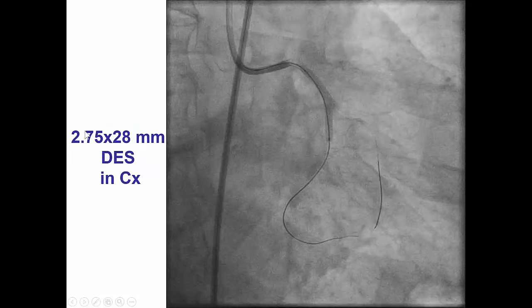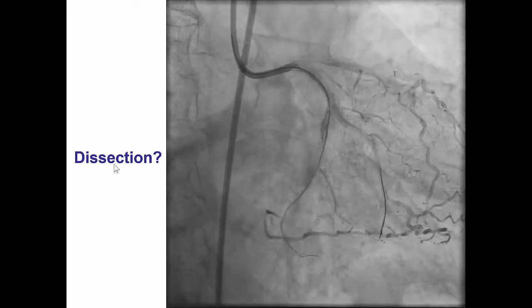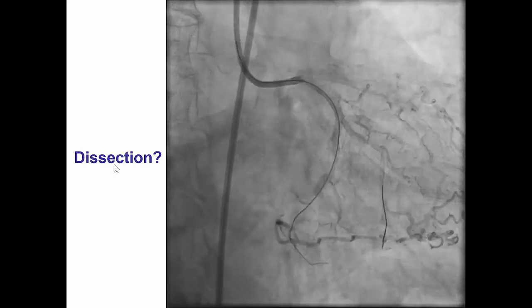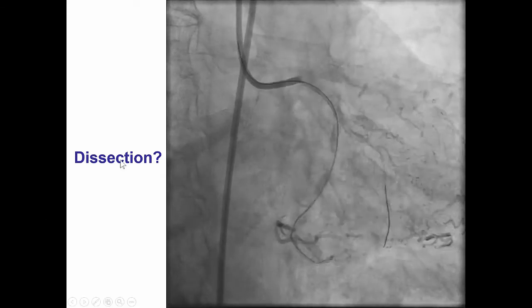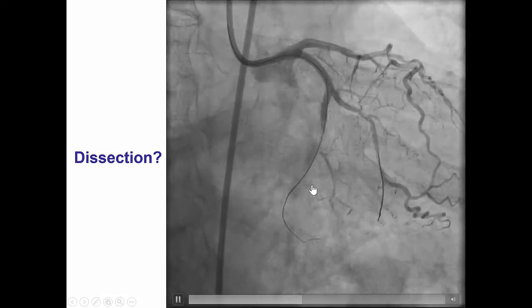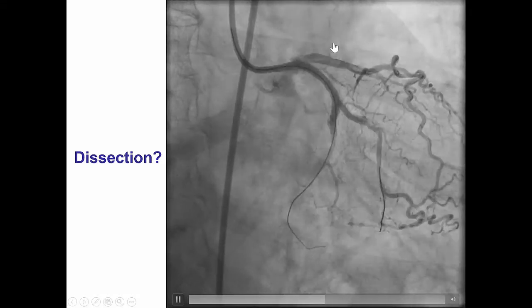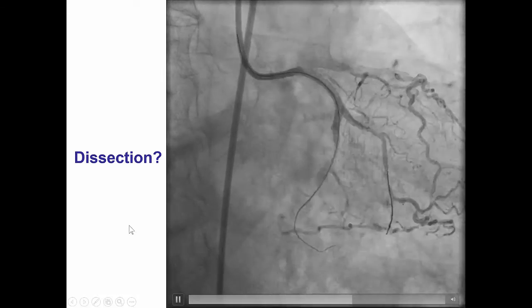We then deployed a 2.75 by 20 millimeter drug-eluting stent in the circumflex. However, after doing that, we were not happy to see that we had poor flow into the circumflex. Therefore, it appears that we were subintimal and had not achieved true lumen reentry into the distal circumflex, although the first obtuse marginal had nice antegrade flow.